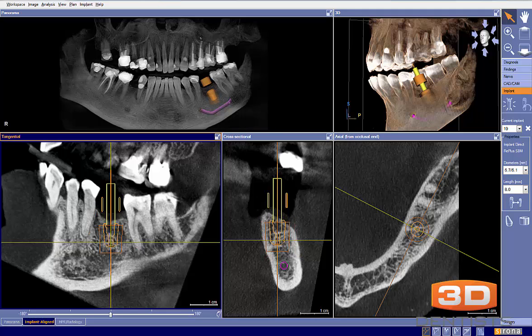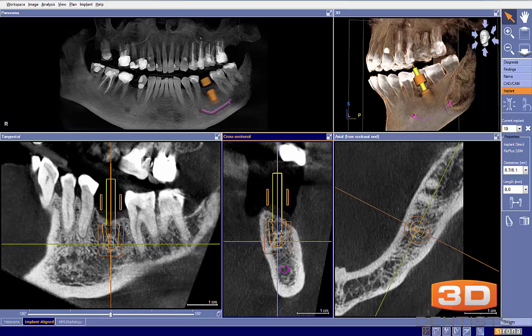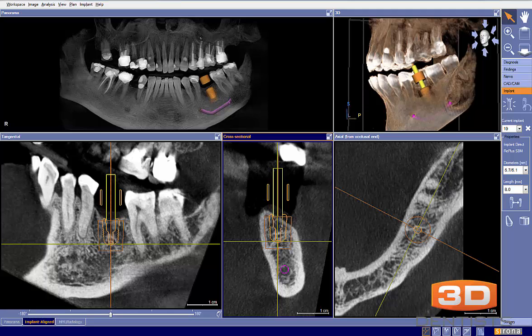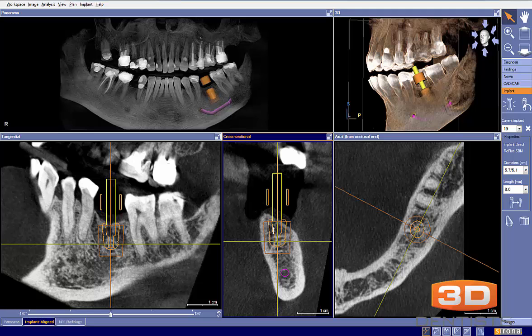The next category we're going to look at is bone level. What I see is that because we've had some bone loss on that buccal ridge — which is very common for this type of resorption — this implant has been placed a little bit deeper. I'm not saying that's incorrect, but personally my preference would be to place the implant a little bit higher, slightly subcrestal, to accommodate for some bone loss that we're going to have.